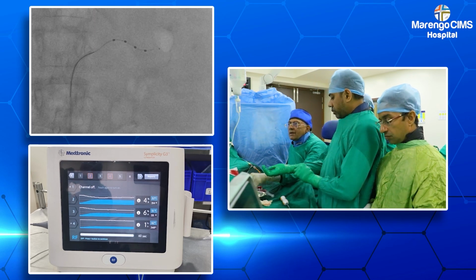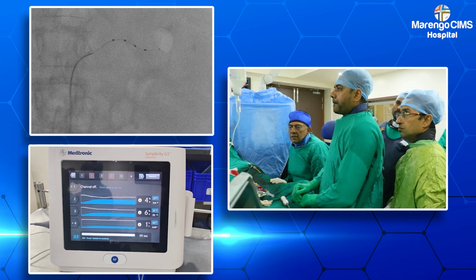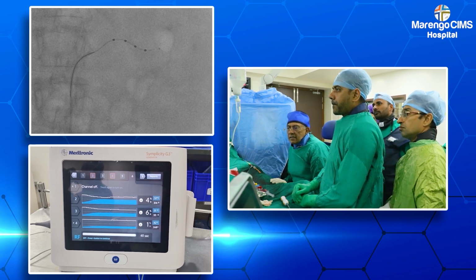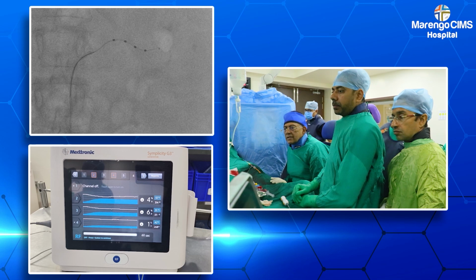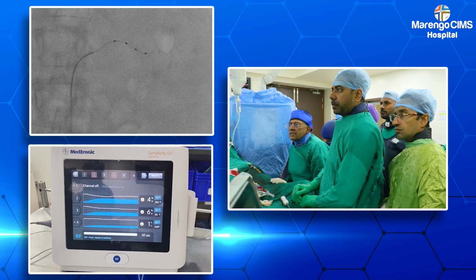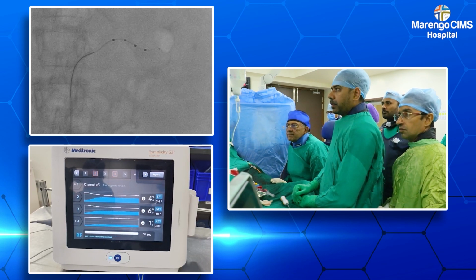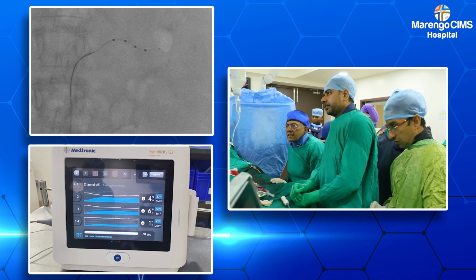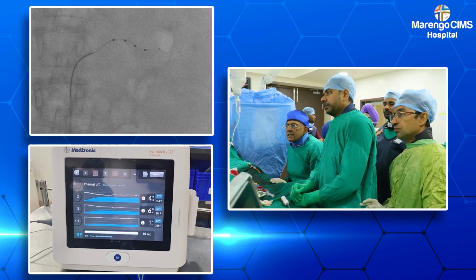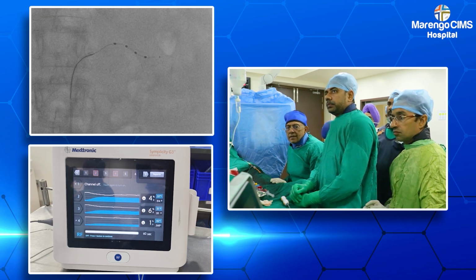So we are done with the ablation. As you have seen, the second, third and fourth channel were activated. And you may wonder why in the fourth channel the temperature rise was not there, but it's time dependent. So since we were able to ablate for more than 45 seconds up to 60 seconds, even though the temperature did not go higher, it was still reasonably high at 42 degrees to create a reasonable burn in that area.